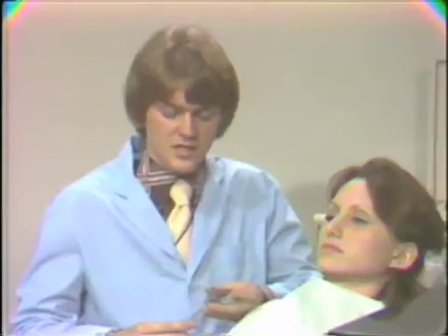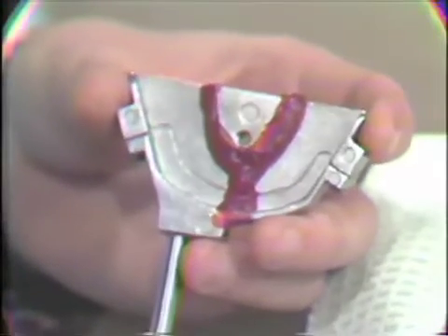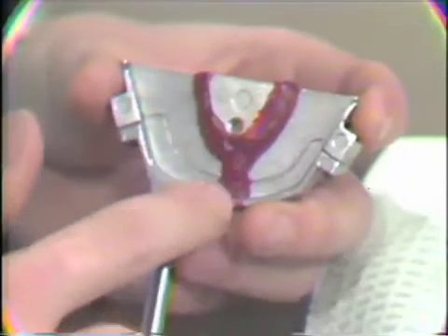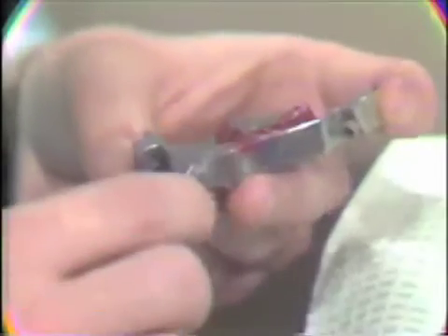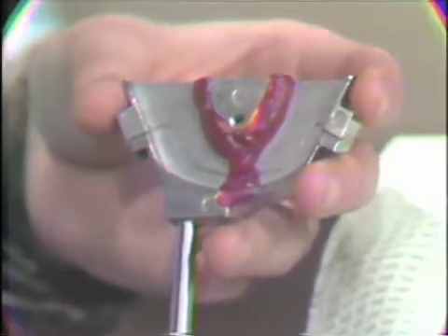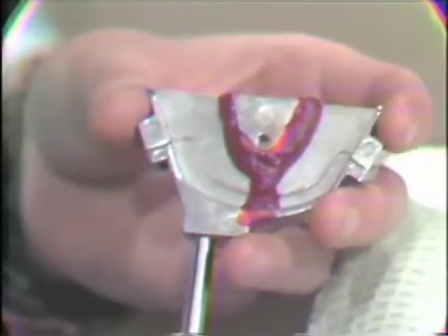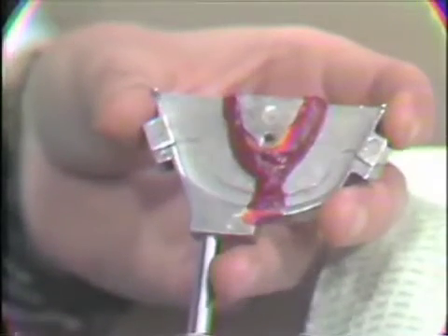The first step of the procedural sequence is the location of the true hinge axis. In doing this, we use a universal clutch to attach the lower member of the hinge axis locator. Notice that wax is placed in such a manner and that it has a two-piece construction that's screwed together to allow for easy removal of the universal clutch. This is attached to the lower jaw, and to this is attached the lower member of the hinge axis locator.